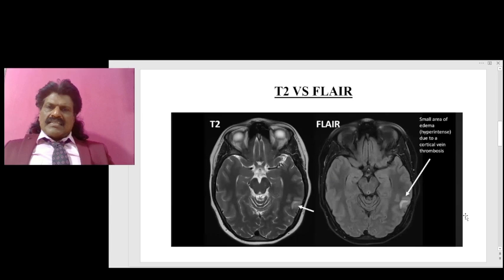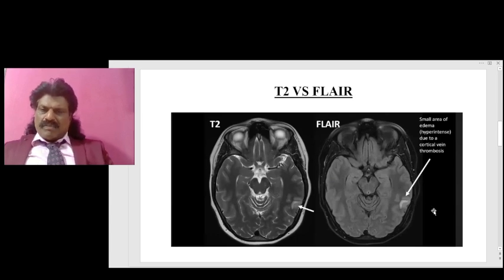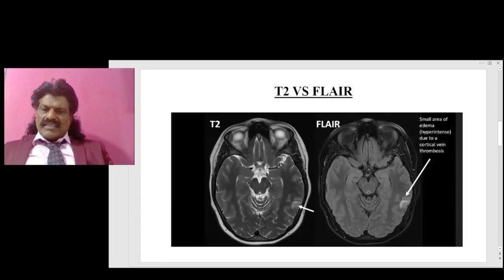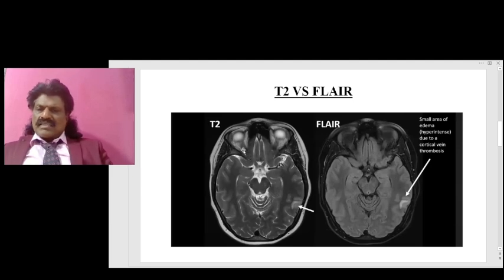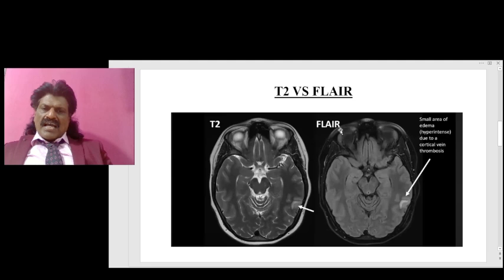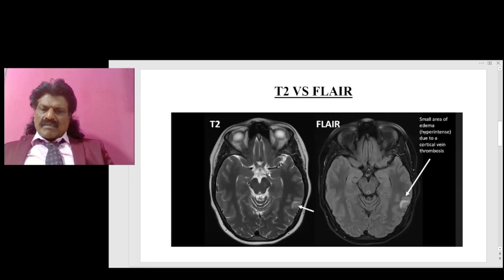Looking at this image, on normal T2 the CSF is bright, the gray matter is hyperintense, and the white matter is dark or hypointense. FLAIR is similar to T2, but the CSF which appears bright on T2 has been suppressed and becomes black on FLAIR.